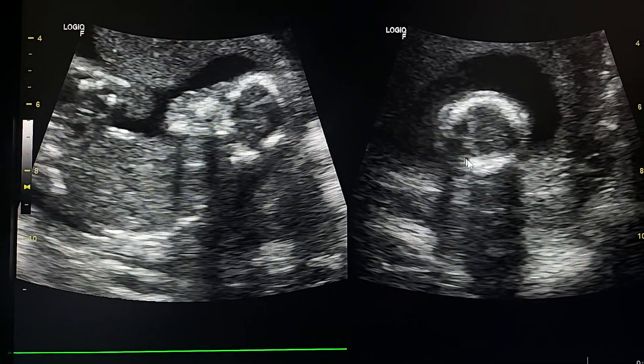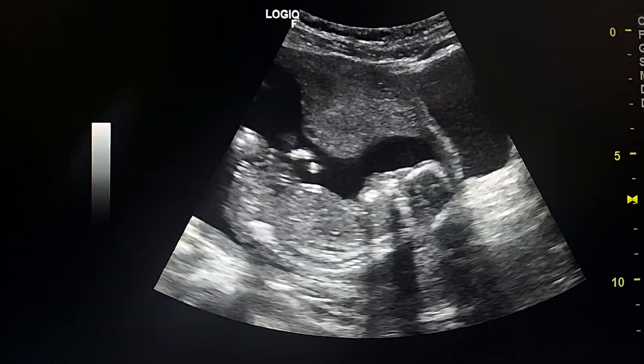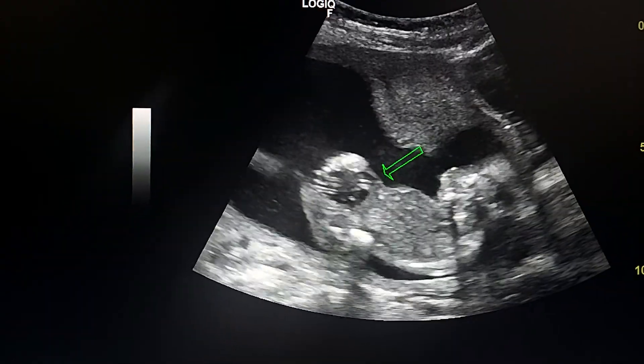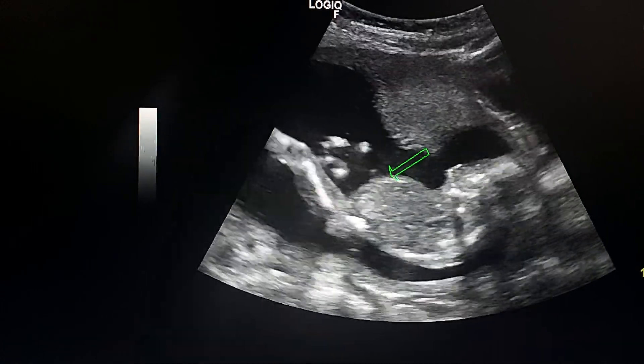Here we see the umbilical cord insertion is normal.